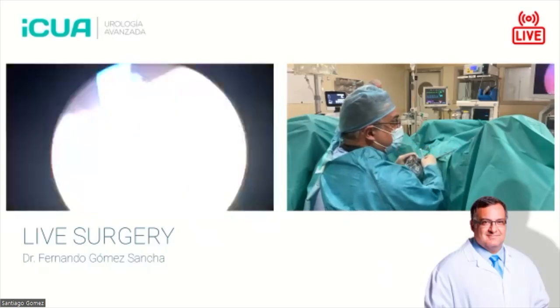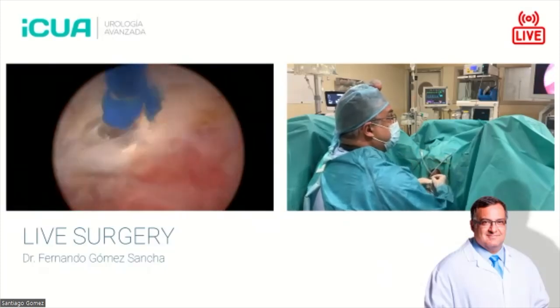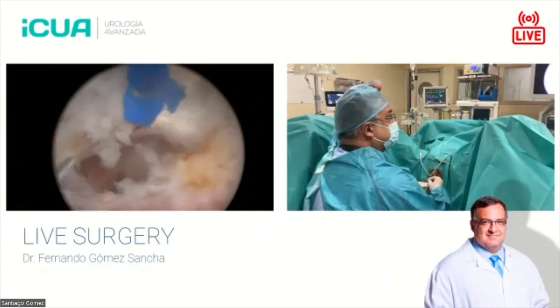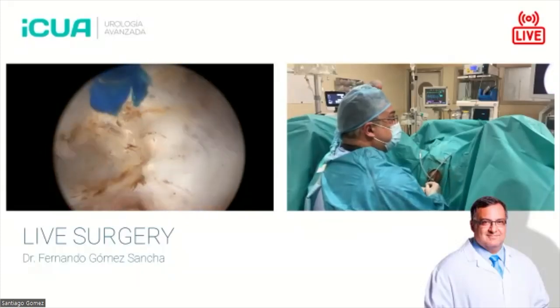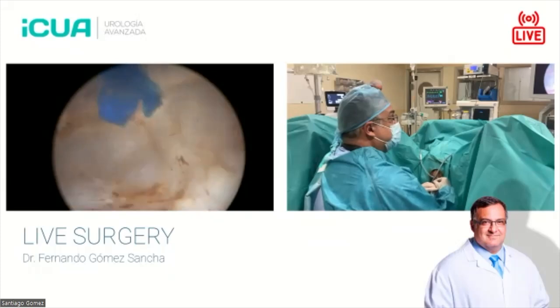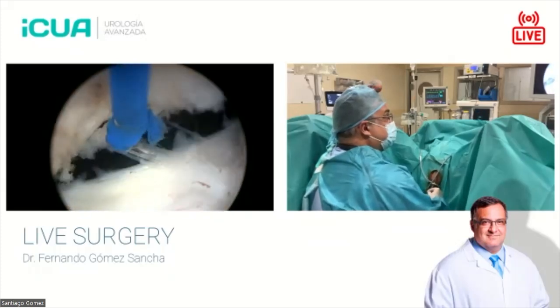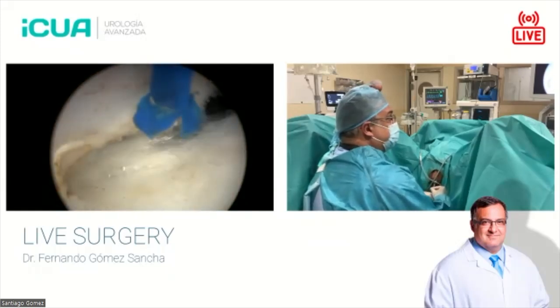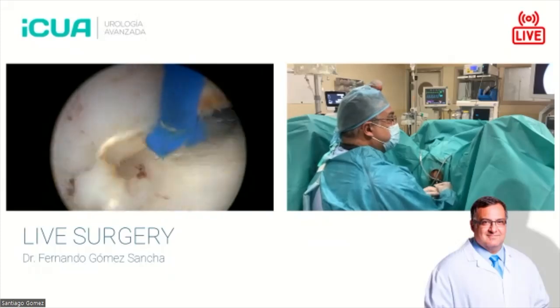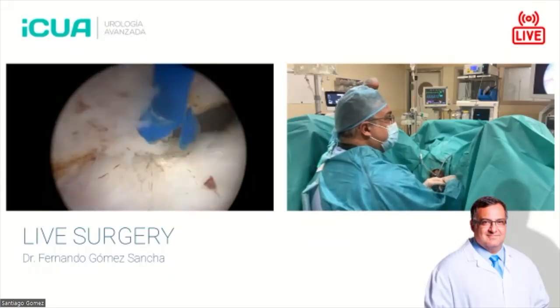That's our UO. And we are now medial to it, so it's quite safe now. So my advice is always try to get the best equipment you cannot afford, not the one you can afford. You have to buy the one you cannot afford, because if you plan to have a certain number of patients, you will have more, because HoLEP brings you a lot of patients.